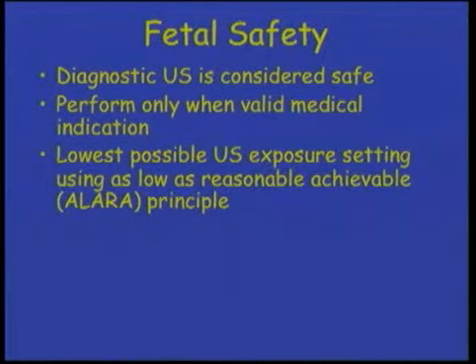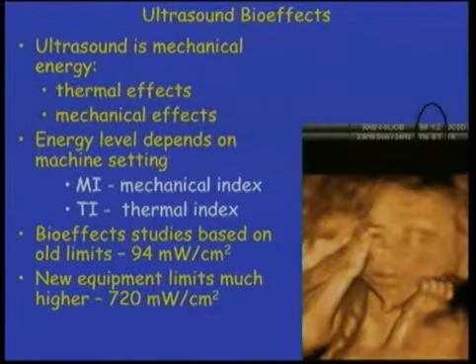Now, for fetal safety, ultrasound is considered to be safe, but we should only perform it when there's a valid medical indication. And that's because we want to use the lowest possible ultrasound exposure settings when we can, to use the same principle, the ALARA principle that we use for radiation, which is as low as reasonably achievable. Now, ultrasound does have bioeffects, and the bioeffects are predominantly related to thermal effects and mechanical effects. The energy levels depend on the machine settings that you use.